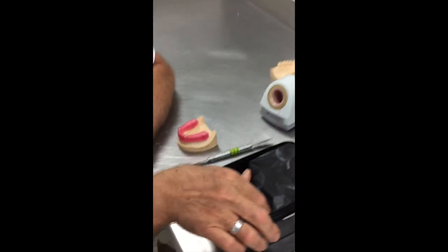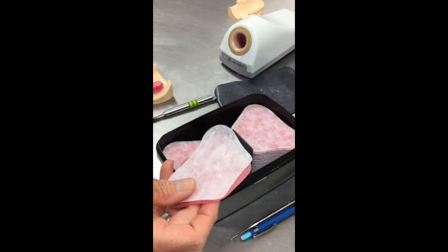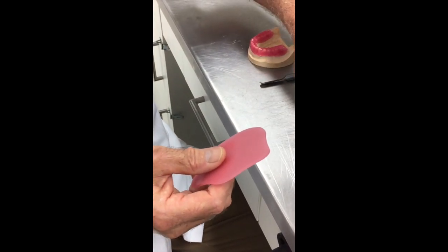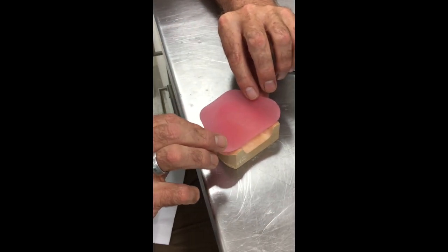In our laboratories, we make acrylic trays because the material is more robust for transport. It's not as brittle. But we are making lots and lots of these, so we're confident and comfortable with adapting them in the short setting time that you have for that material. So we're going to make one with the light cured material. The technique would be the same, only you've got all the time in the world with this material. There's all manner of these materials on the market. You can source them from most dental companies. This particular one has a pink colour, but there are lots of different colours put out by different companies. So we're going to make this tray in this to adapt it.